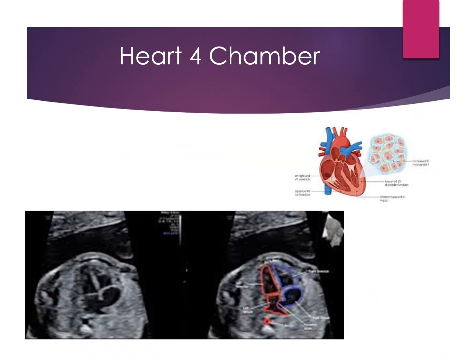So the heart has 4 chambers, and we see that in a pediatric patient. But I'm going to just go over how we are scanning this. If we are in a true transverse view on the baby, we are never going to see the 4 chambers, because the heart sits slanted, and the ventricles are on either side. So you almost have to go oblique in order to cut through the 4-chamber heart.